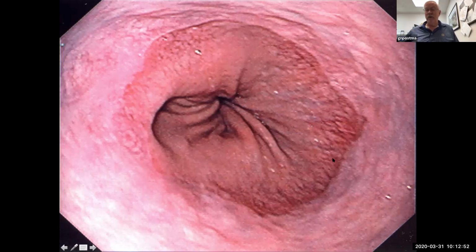Now, people, what do you do with all these biopsies? We biopsy sometimes when it's obvious, but more often than not, when I have a patient with clinical Barrett's, I am more likely than not to refer that patient to a gastroenterologist. Some of my otolaryngology colleagues disagree, but there is a specified protocol that you should do 4 quadrant biopsies for every 2 centimeters of Barrett's esophagus. That's a lot of biopsying. And although patients are pretty tolerant with these exams, biopsy after biopsy after biopsy, the patient gets tired of it. We get tired of it, frankly, especially if you do the proper number of biopsies.